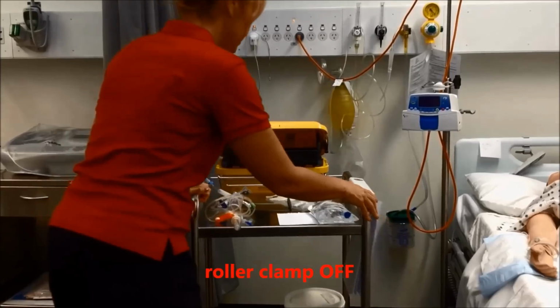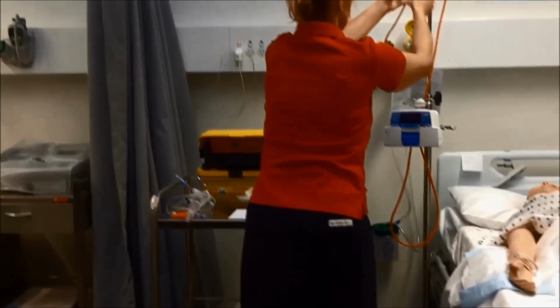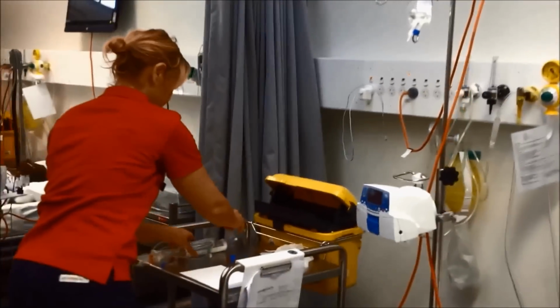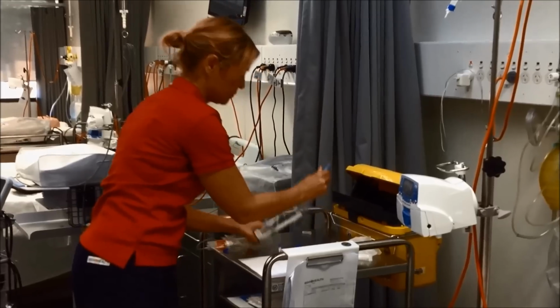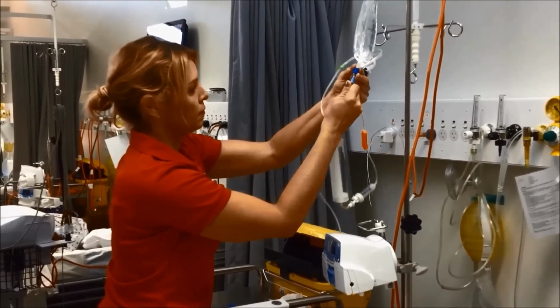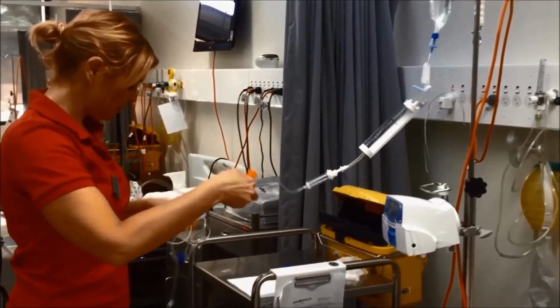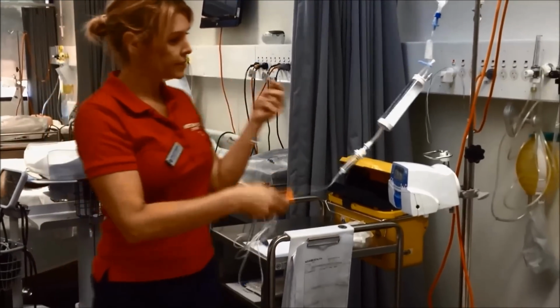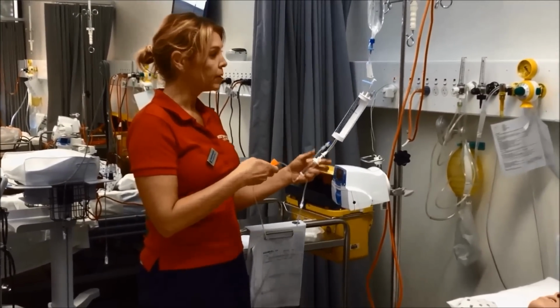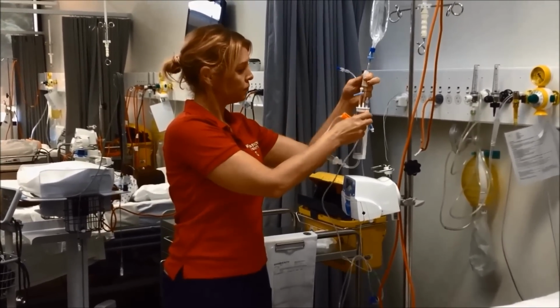And then my line's ready to go. Line it up. Now my order states I need 100 mils, so I'm going to put in approximately 100 mils, but then I'll top that up when I put in my antibiotic.